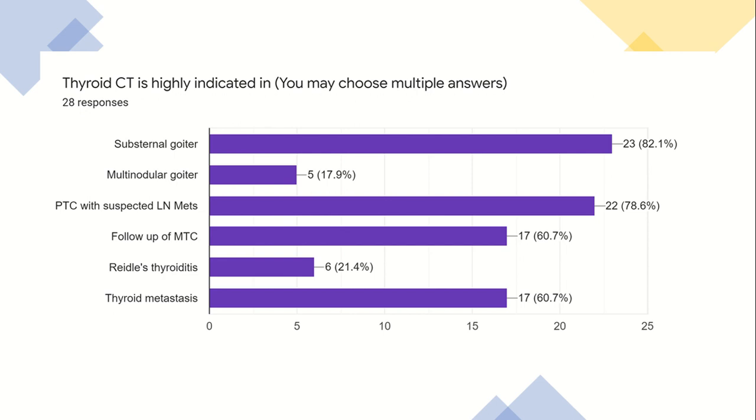Backing to your survey, thyroid CT is highly indicated in these cases: substernal goiter, multinodular goiter, PTC with METs or MTC with METs, thyroid metastasis also, and riedel thyroiditis. Perioperative assessment is also something we sometimes need.